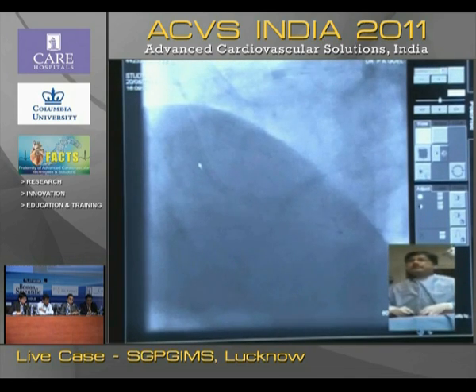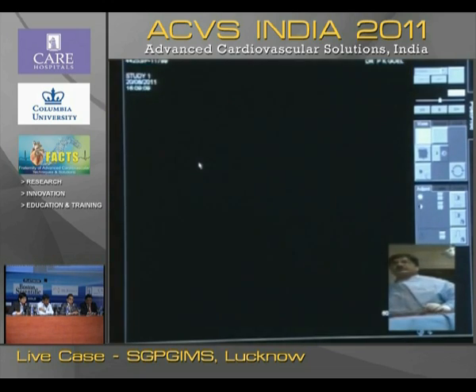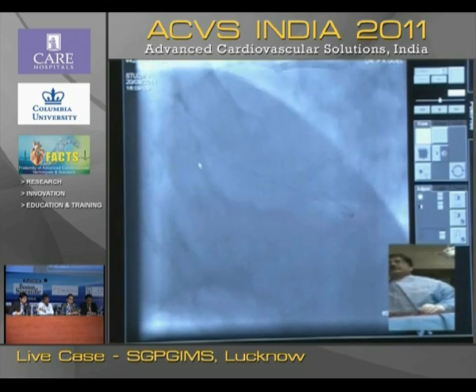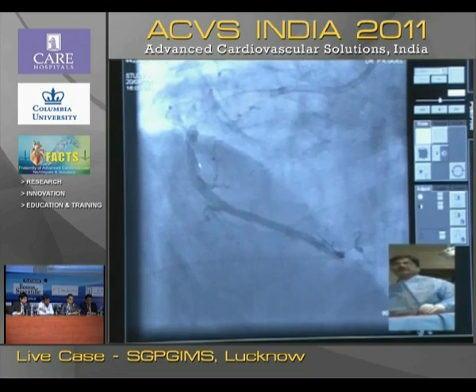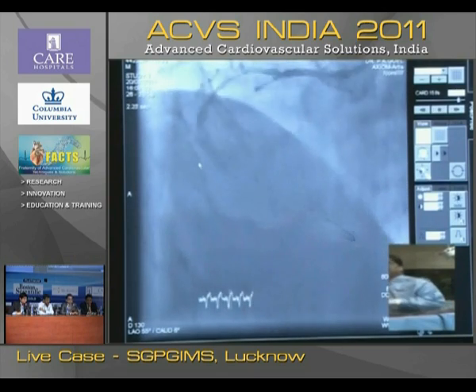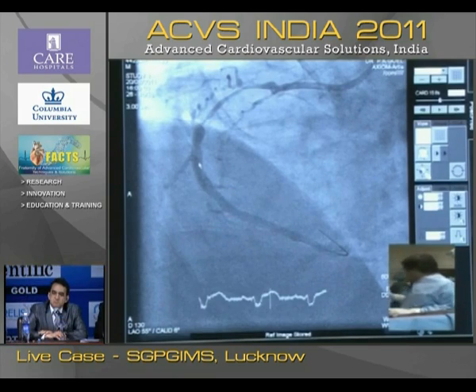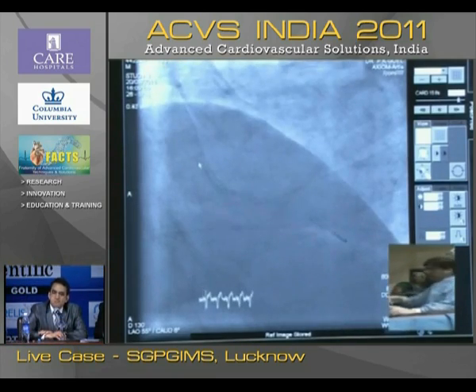Let me see an angiogram. Inject, please. Okay, I think that is okay. So we need to do some more balloon work there. Come on, 2.5 balloon. You have 20 minutes left.